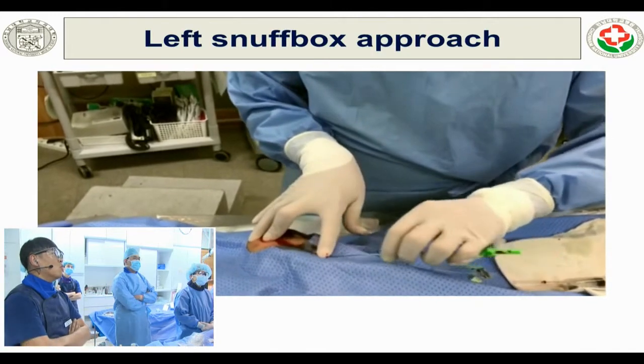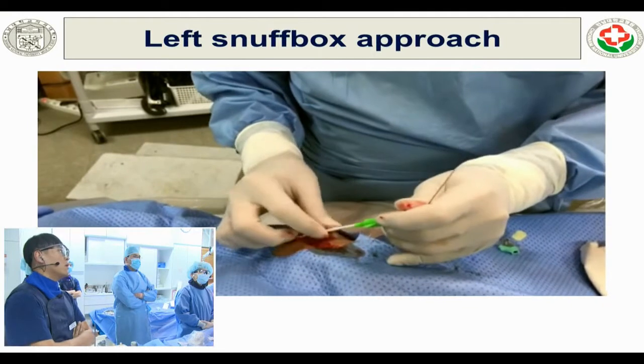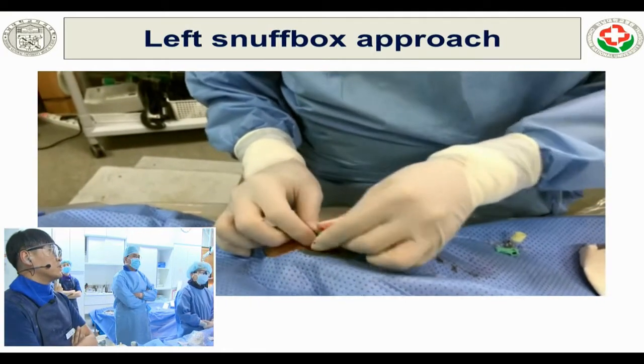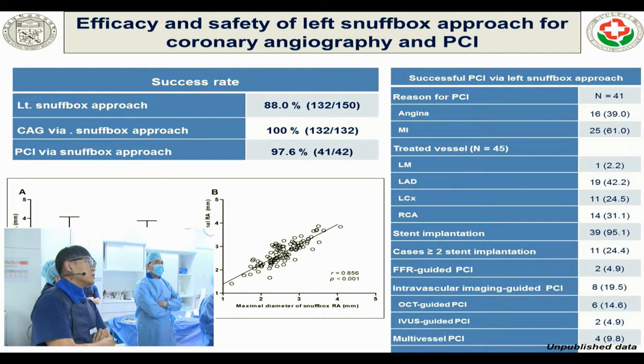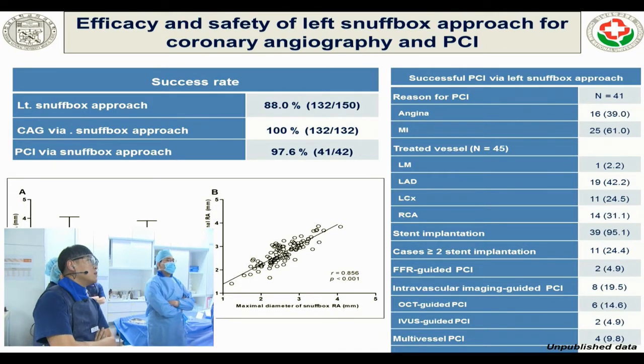In all patients, we performed the coronary angiogram via 6 French sheaths, with 100% success for coronary angiogram via left snuffbox approach. Regarding PCI by the snuffbox approach, the success rate is 97%.